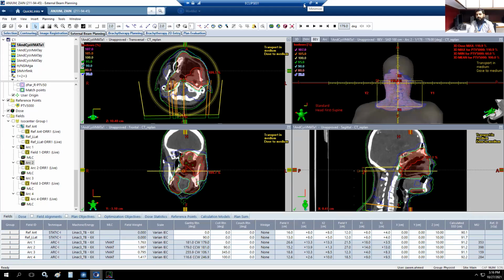Mohsen, what I have experienced is that if you have proper constraints defined and proper arc selection, and if you have multiple arcs, like if you're planning a head patient, then you will get good dose homogeneity. Otherwise, if you do not have very good dose homogeneity, you can define structures for it, like the other contours which were included in my slide. It would be helpful in bringing the dose homogeneity.